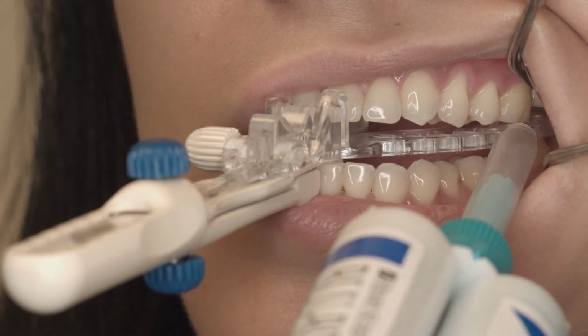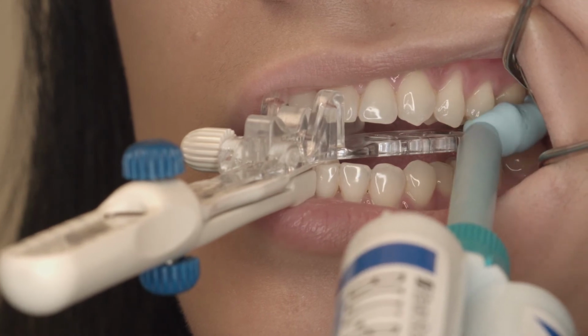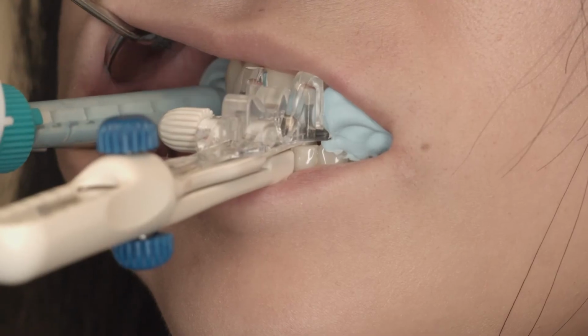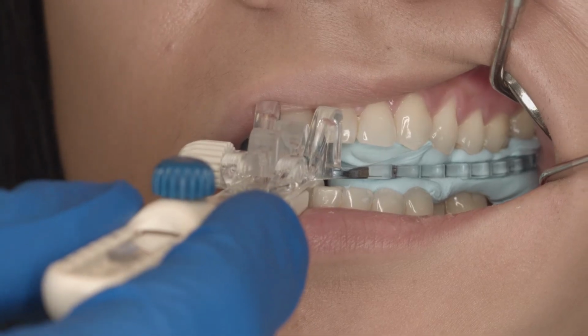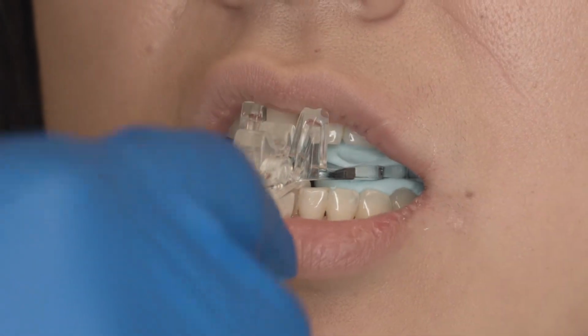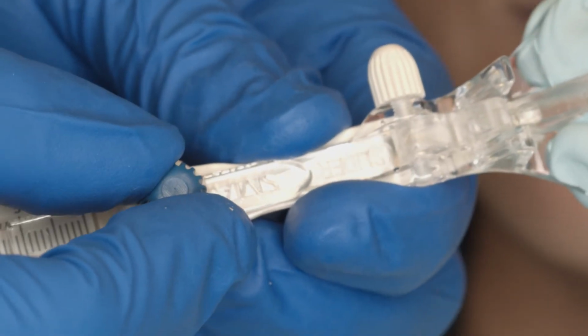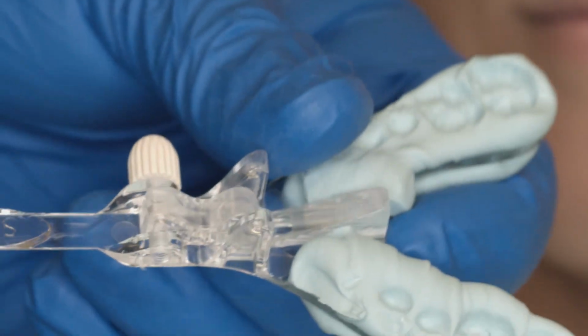Step 5. Using a stiff silicone, inject the medium thoroughly on left and right sides, extending completely from anterior to posteriors. PVS is recommended for reliable bite records. Once the medium has hardened, remove SOMGauge from the mouth. Loosen the upper screw, remove the bite fork, and send the fork to your local SomnoDent provider.